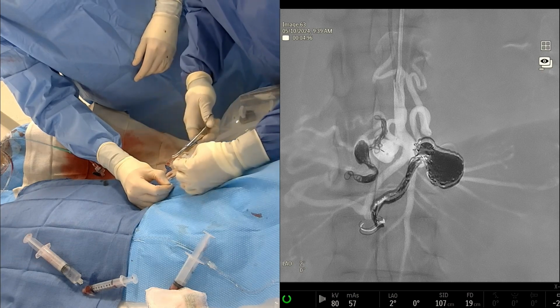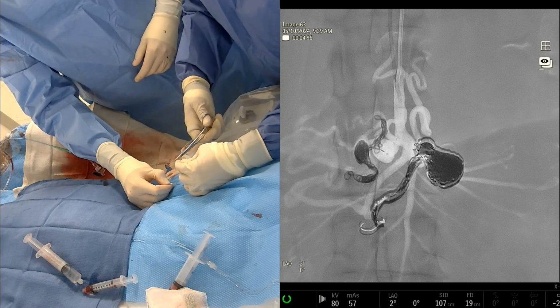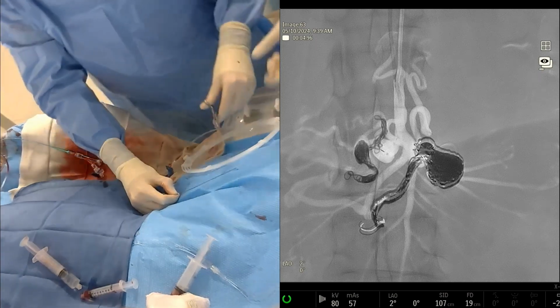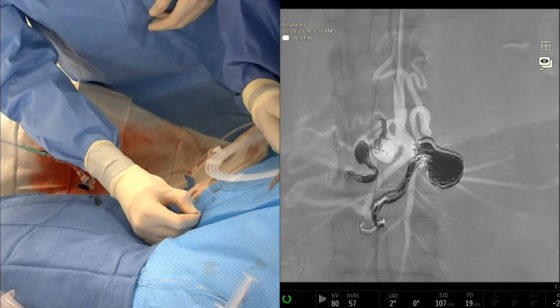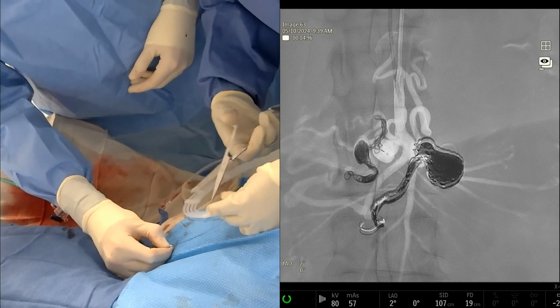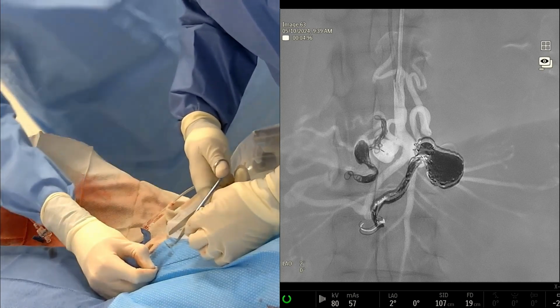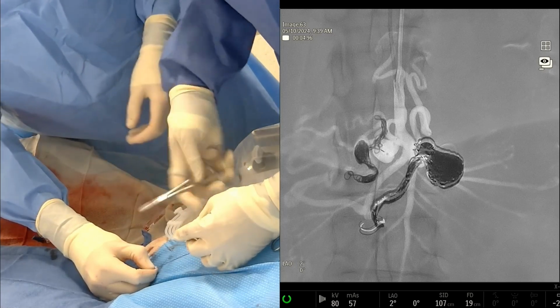So here's where we get a little problem. We've pulled it and the pin wire broke before we could pull it. It's weird. I don't think I've ever seen that one. I've seen it once. How'd you guys manage it? Cut it. It takes some force, but cut the pin again. This is great to see because if you're using a lot of coils in a case, 10, 20 coils, there's usually a couple coils that don't deploy exactly the way they should.